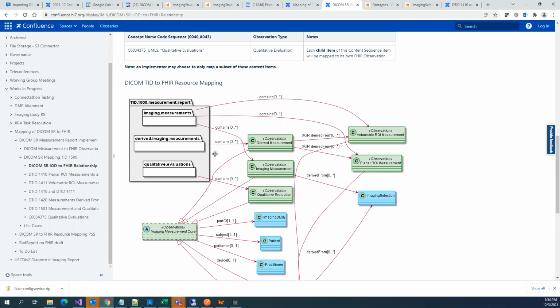So it's just a mapping which we'll be putting there, and you will convert that mapping to your separate languages actually. Okay. Tomorrow we'll be having a session on Scriban. At least some templating language idea will be given to you, and then you can take that further. Okay. Any other questions?